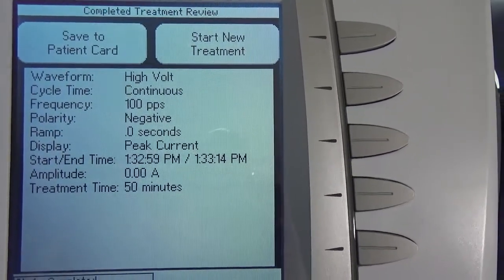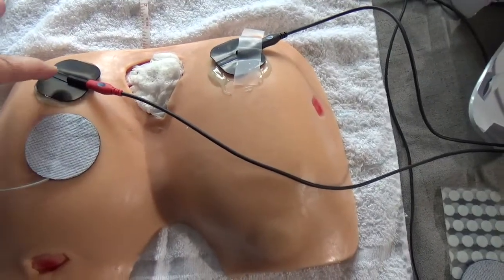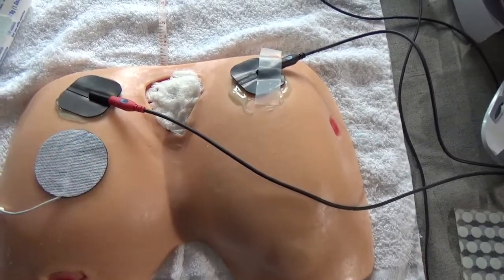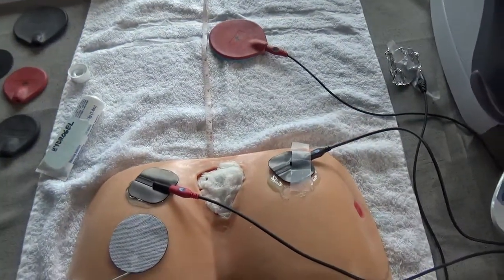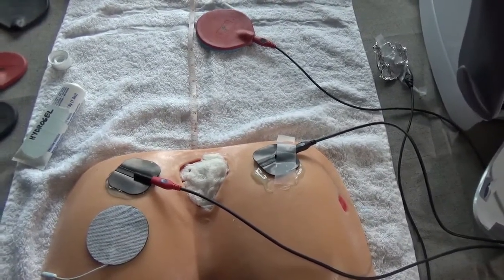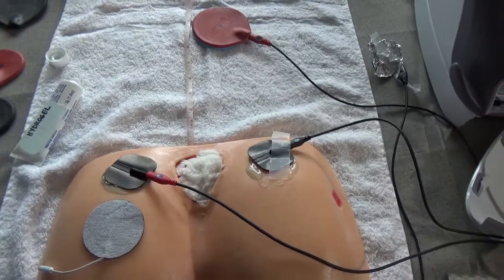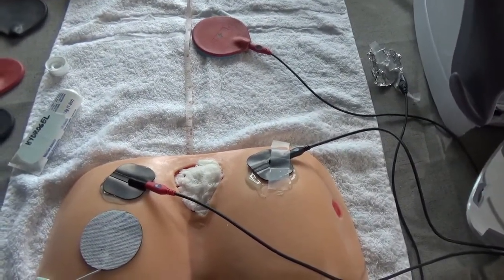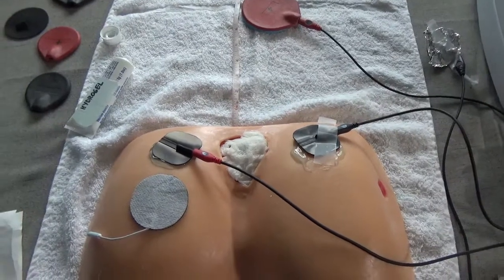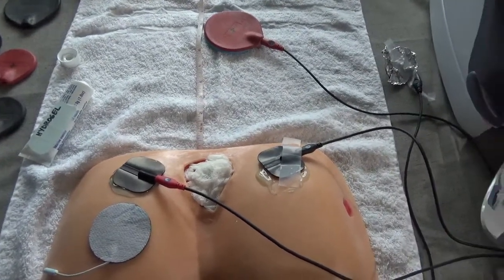After you complete your treatment, simply take off your electrodes and either cleanse them, keep them for the patient in the patient's room, or throw them away. For an hour-long treatment of this sacral wound the patient is probably in sidelying, so you'd want to make sure you have everything secured and check on them periodically during treatment to make sure they're not having any stinging or burning and haven't moved off the electrode. After cleanup, take the saline gauze out of the wound and pack it with an advanced wound dressing or whatever is in your treatment plan.